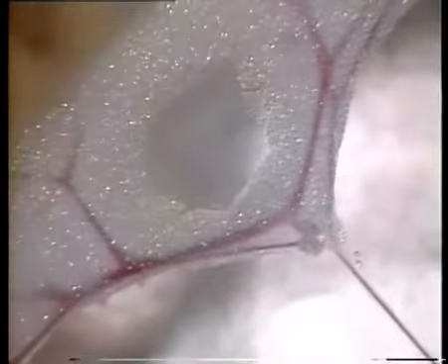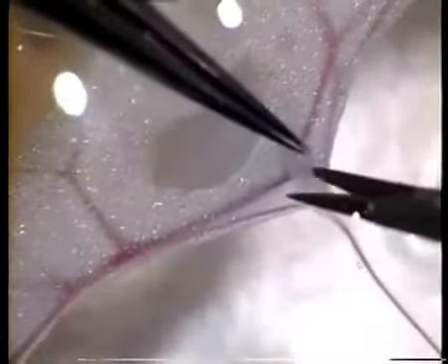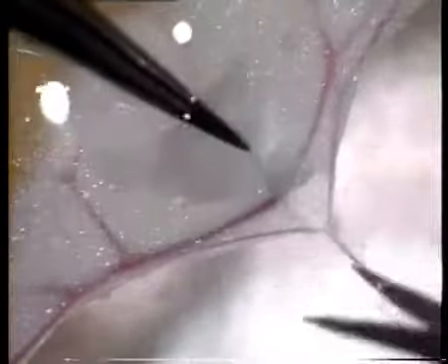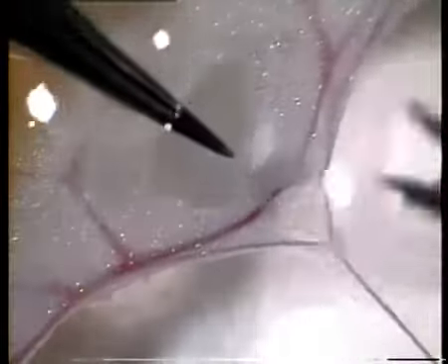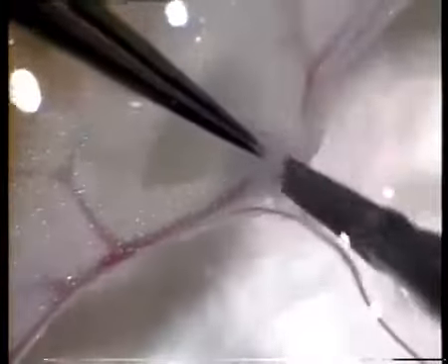When you get to the next branching point, you begin cleaning up and continue down to the third or even fourth branches. You will finally end up using the third or fourth branch vessel, but you will take the first or second branch also. The larger branches make it easier to mount the smaller branches onto the myograph wire.